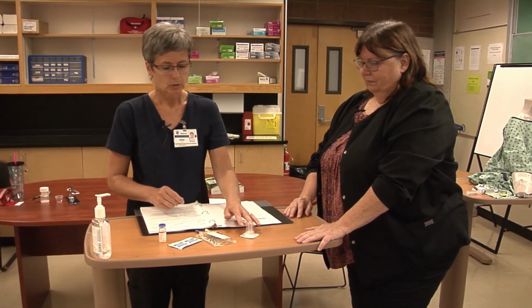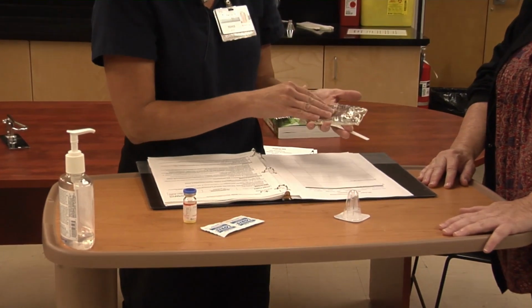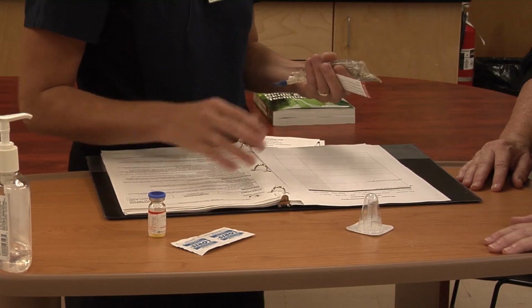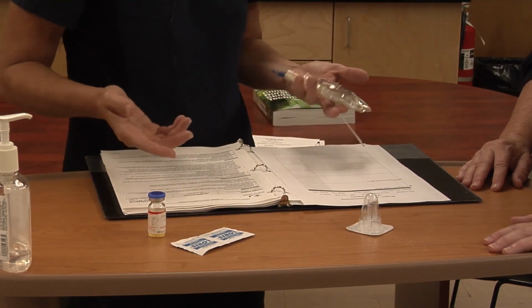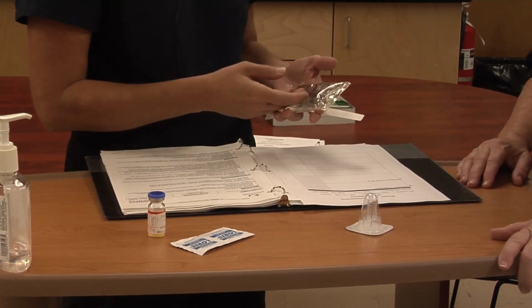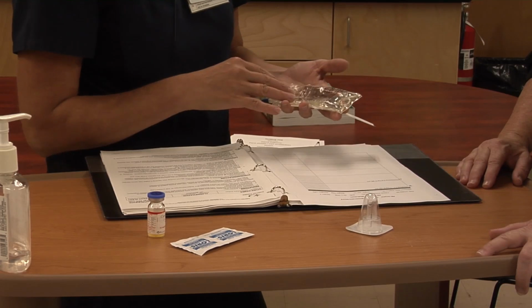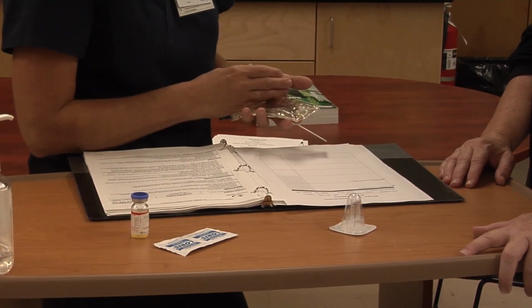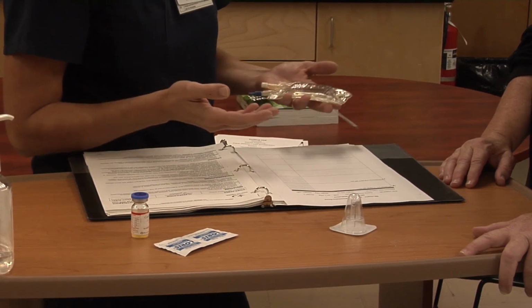So we'll talk about the easiest way first. Okay, so you need your IV mini bag, and you decide on that volume by going and looking at the drug monograph or in your parenteral practices manual, and it's pretty clear. It gives you directions. It might give you a range of volume that you can mix it with, in which case, so let's say I could mix this particular drug with 50 to 100 mils of normal saline. I would choose the volume based on patient factors.